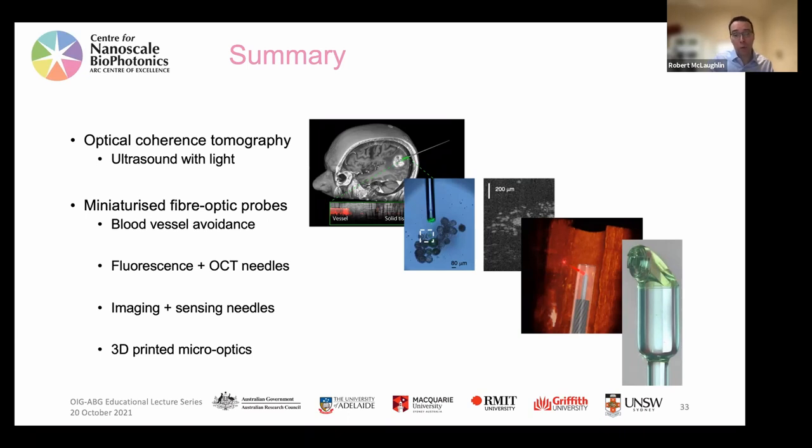Once again, you can still work with these, but our experience was that when we partnered with people who really understood the magic inside the box, we were able to suddenly push the bounds of what we could do with 3D printing. And as researchers, we're always trying to push the technology a little bit more, like, can I have different types of materials, which is possible, or could I 3D print a moving part in there somehow, something that can actually move around?